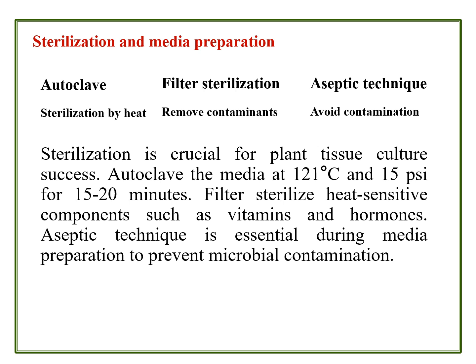And then aseptic techniques. These include either physical or chemical modes of operations during the media preparation to prevent microbial contamination further.